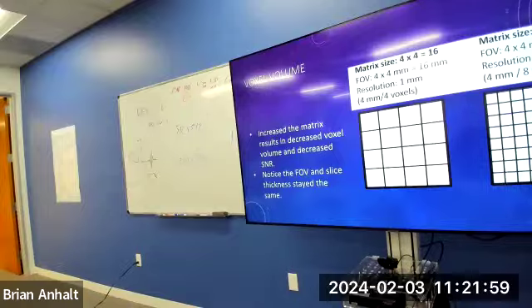That's not something we're really going to get into today. They're not always going to be exactly the same. We can make it 512, and typically, and I'll show you, this will come up, mostly it's going to be a lower number in the phase direction, because that directly affects scan time, TR times NEX. So we can have rectangular pixels, which we normally do. We're losing a little bit of resolution, but we're gaining a lot of scan time.